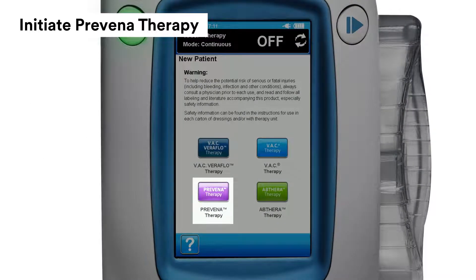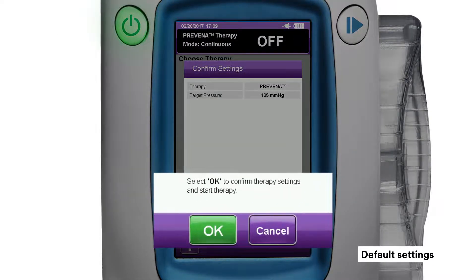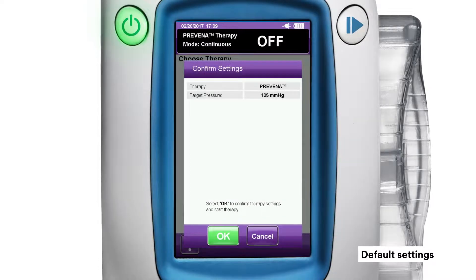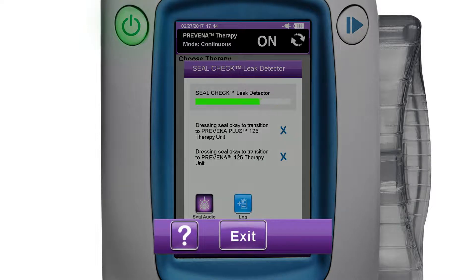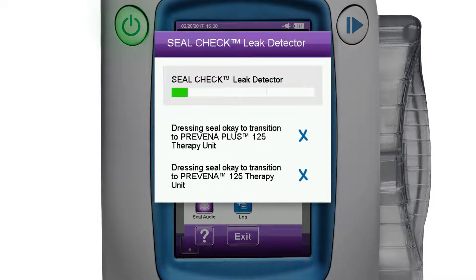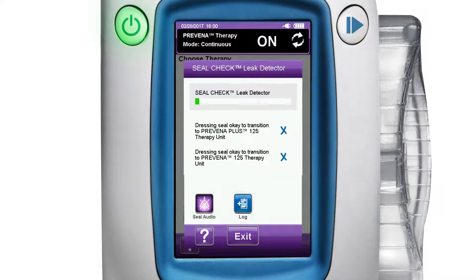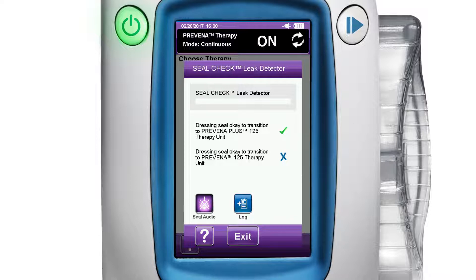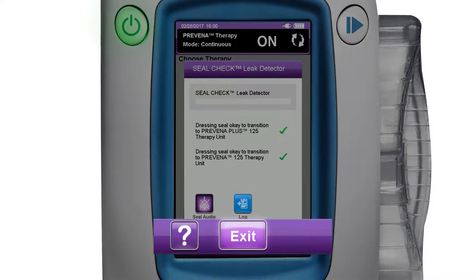To initiate Praveena therapy, press the purple Praveena therapy button. Next, press the green OK button on the confirmation screen to accept default settings and begin Praveena therapy. Confirm seal check, then press the purple exit button if not transitioning to a Praveena therapy unit. The seal check screen assesses leak rates for subsequent transition to a portable, disposable therapy unit, such as 3M Praveena Plus 125 or 3M Praveena 125 therapy unit. The seal check leak detector screen will display an X if the dressing seal is not adequate, or a check mark if it is adequate for use with the associated Praveena therapy unit. Press the exit button to return to the home screen.